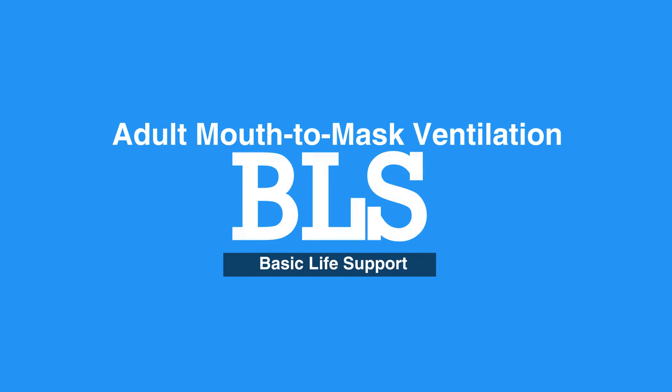Welcome to Adult Mouth-to-Mask Ventilation. In this video, we will discuss the use of a mask to deliver breaths in one-rescuer CPR.